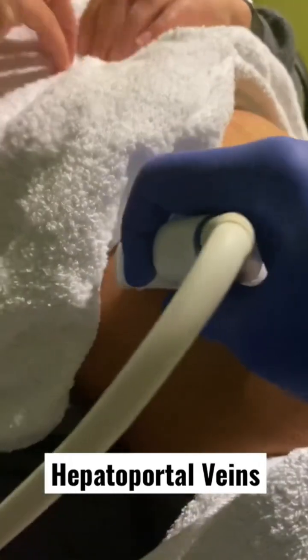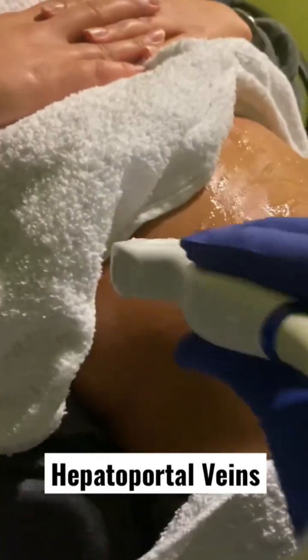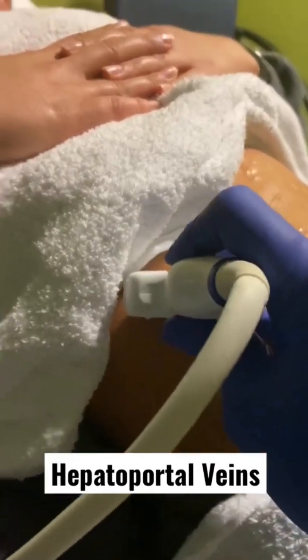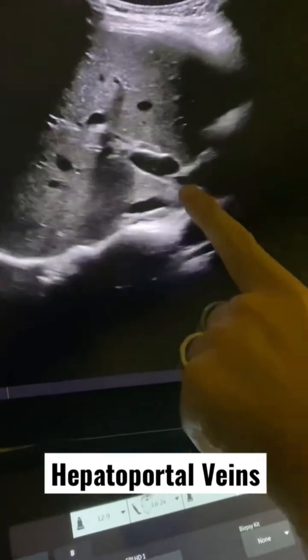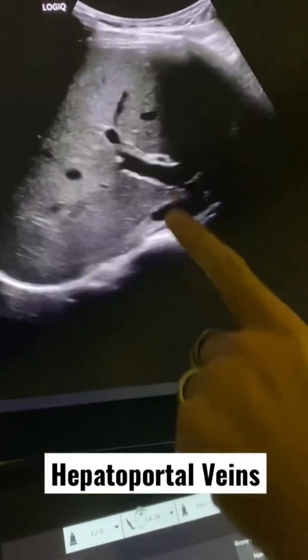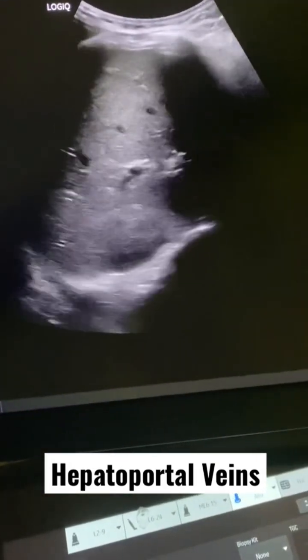As I showed earlier, to get the portal vein you want to come at an angle along with the ribs right there. So that's your main portal vein. The main portal vein bifurcates into right and left.